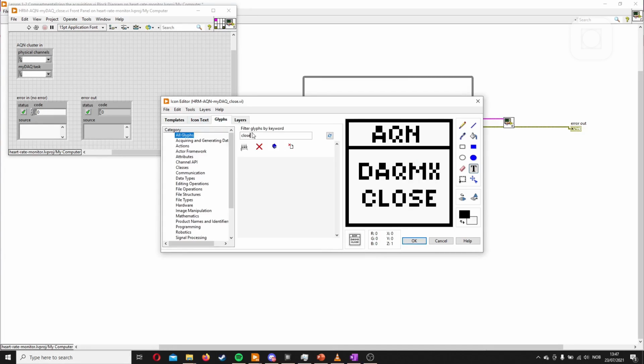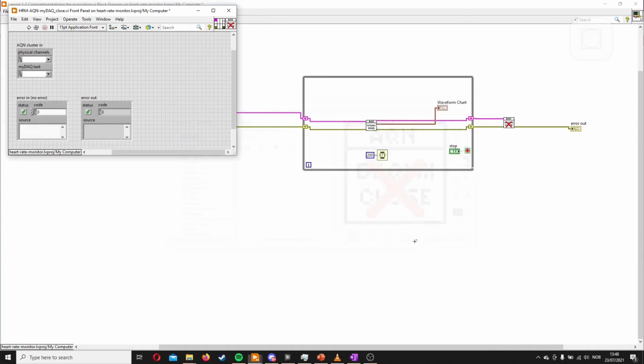And what we can do now is, as you see, I already searched for close, but you just search for what you want. And then you can add an icon. Usually I would add more icons to this than maybe I have done on these, but I don't want to spend time on that. You can make icons on your own. This is just to show you how it could be done.